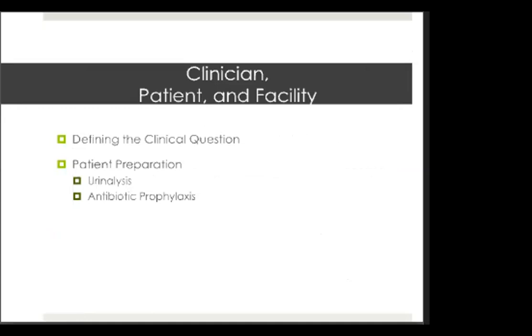We can give a list of problems or questions that should be solved or answered during the test. During the urodynamics, there are instructions to the patient. For example, at first sensation, the patient should not void right away. There is staging: only when the urge is really strong should they void.